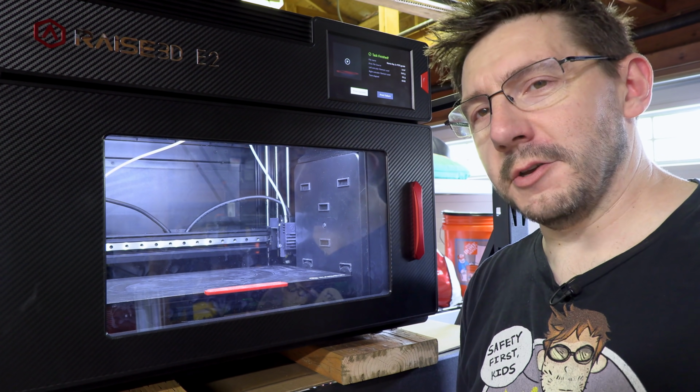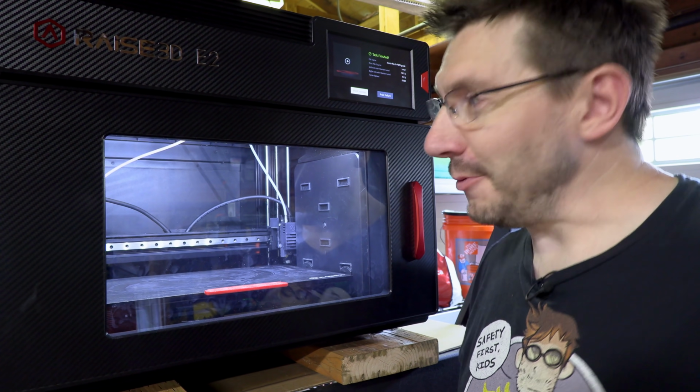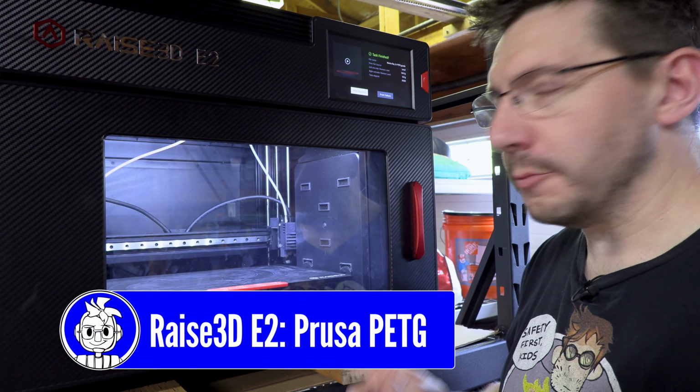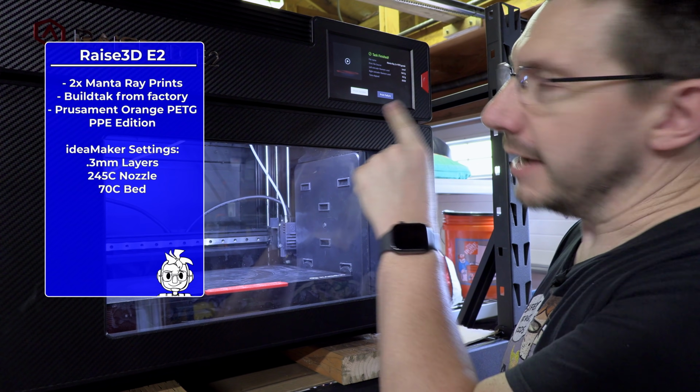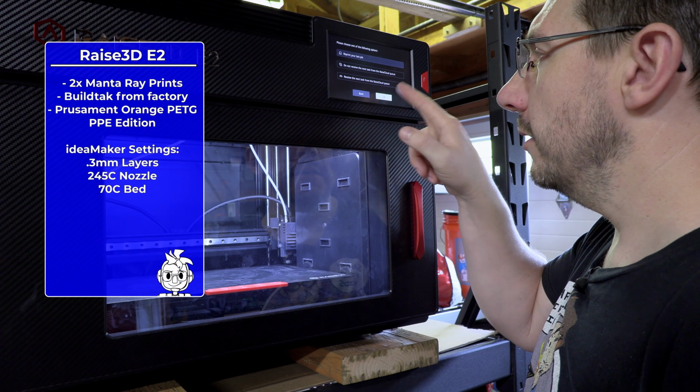Next printer. Last machine that I'm currently using, this other E2. And just so you know, this is my garage and I had to move my shop vac out of the way to stand here. But this one is very similar to the other one. It's running Prusament PPE Orange PETG, and it's got that thing up top. So yes, the last print was a success. Reprint my job, okay. And that's it, that printer goes.